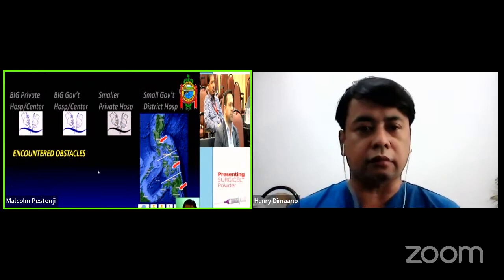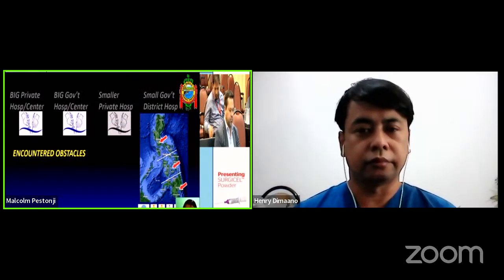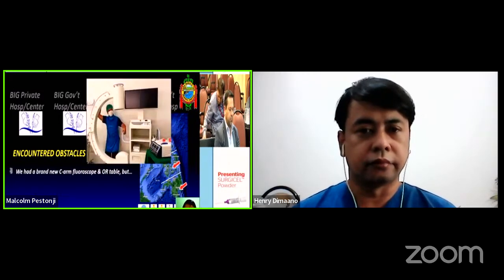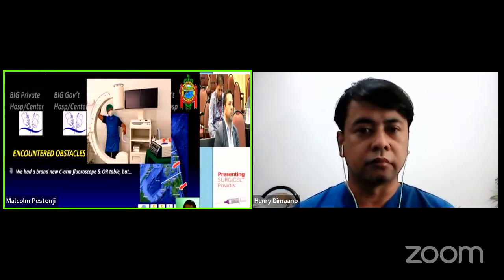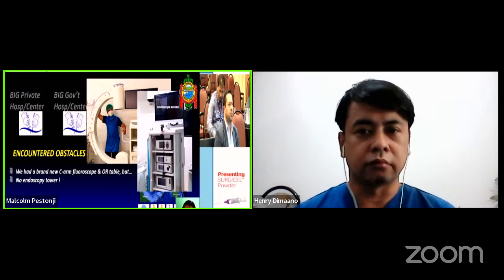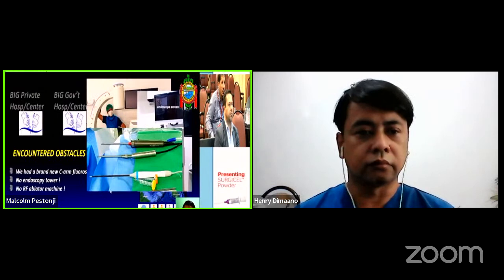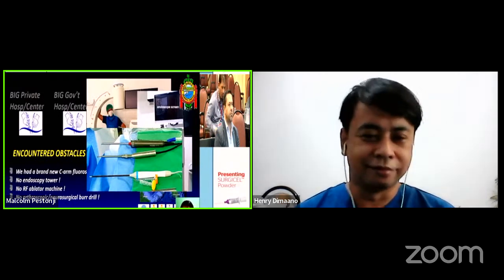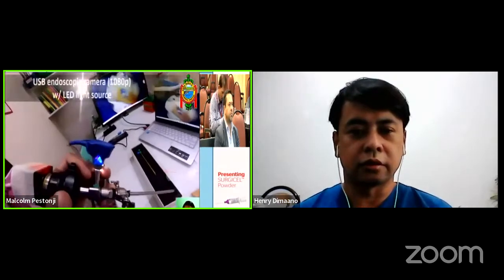Okay, some obstacles that we encountered, of course, when we brought the technology to a remote, underserved area. Okay, we had the C-arm. We were lucky enough that our provincial governor bought the hospital a C-arm fluoroscope. What we did not have was an endoscope tower. We did not have this when we started. We still have no radiofrequency ablator machine, nor do we have any kind of arthroscopic burr or neurosurgical burr or drill.